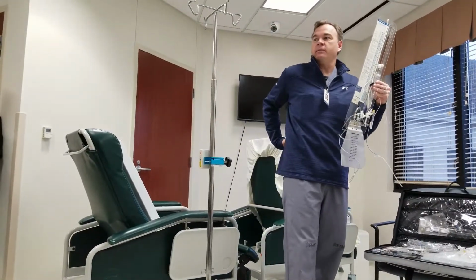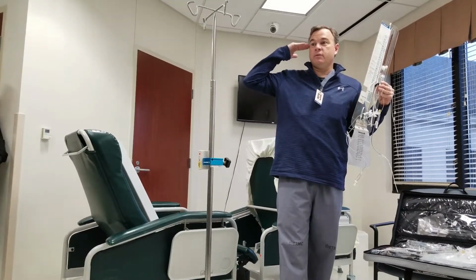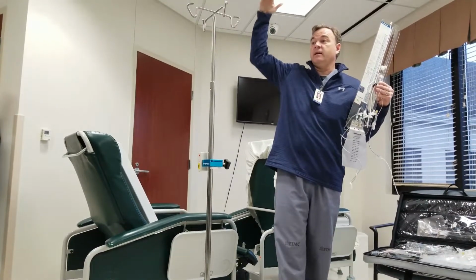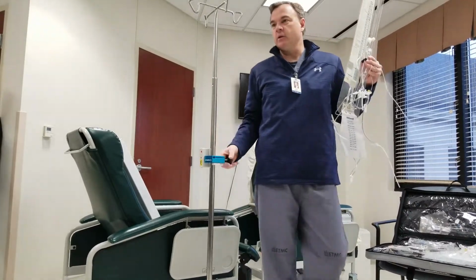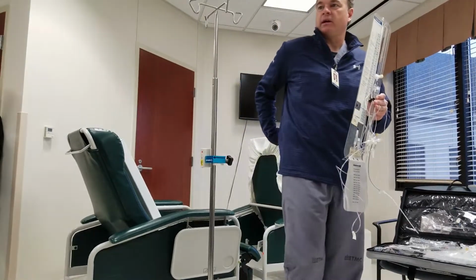Instead of the zero point being the puncture site, it's actually the foramen, and the exact same principles apply. It just has wherever the drain is in spatial relation to that zeroing point. But for you guys, obviously you don't do cranies, you're not going to be seeing it. The zeroing point is the puncture site.